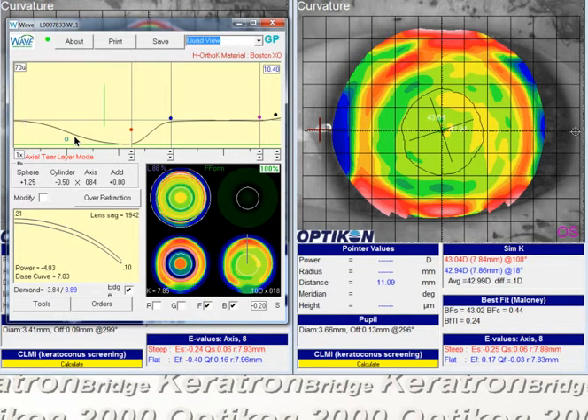While the video was paused, I clicked down on the red dot and gave ourselves another diopter and a half of topo demand for hyperopia. Those are probably the changes I would make first on this lens — see if it'll stay put a little bit more and if the increased demand will get us a little more steepening at the center of the cornea.